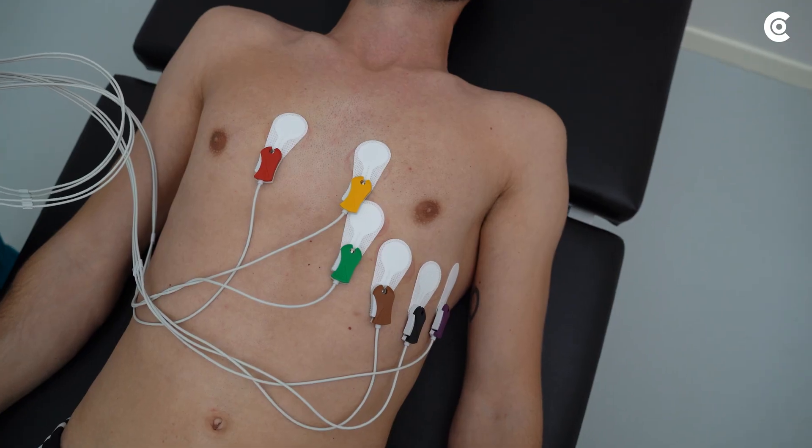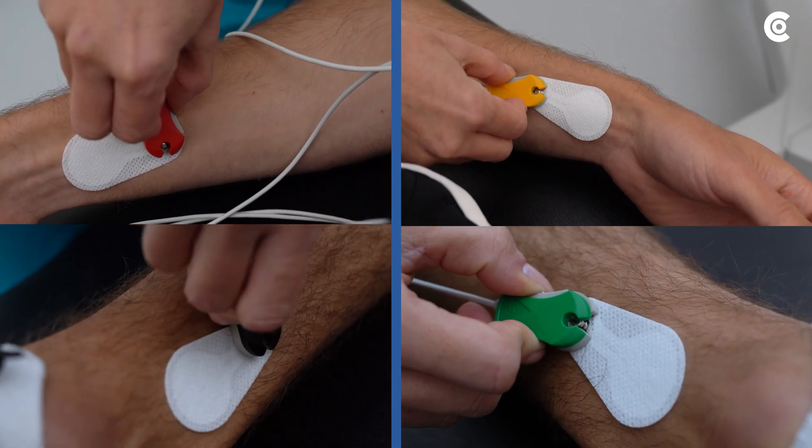For measurement with Cardio 300, you have to put the clips on the electrodes additionally.